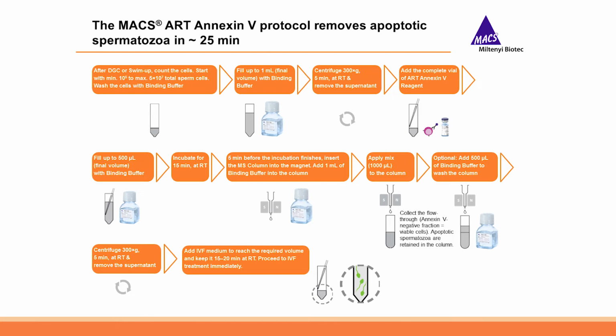It takes around 25 minutes, and what you need to do after density gradient centrifugation is first to count the cells. So the minimum threshold here would be overall 100,000 to a maximum of 50 million total sperm cells. Please bear in mind that the total number of sperm cells differs from the starting concentration of the sample. And after that, you can wash the cells with the binding buffer and centrifuge 5 minutes at 300 G at room temperature to remove the supernatant.